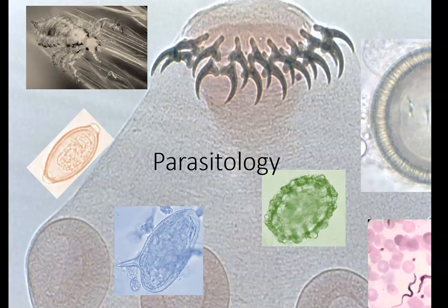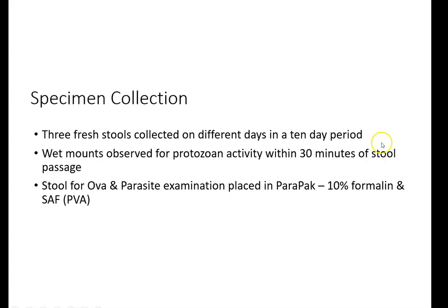Okay, so we need to cover parasitology. And there's a bunch of stuff on this screen that all goes with parasitology. So when we come back to that, or when we look at it again, I hope that you'll understand a little bit more of what you're seeing. For parasitology, more often than not, what we look at are stools.